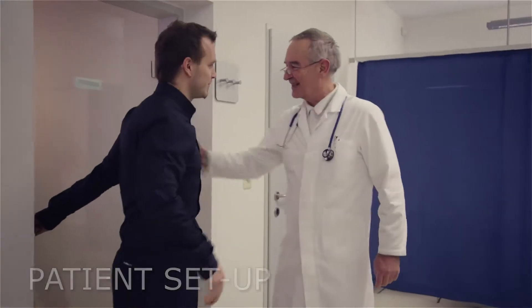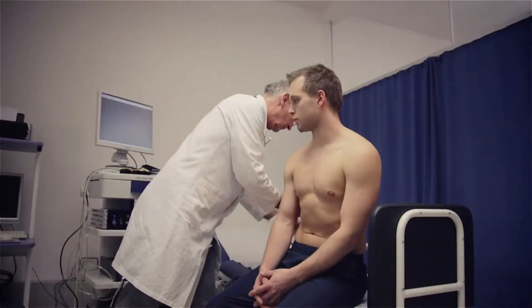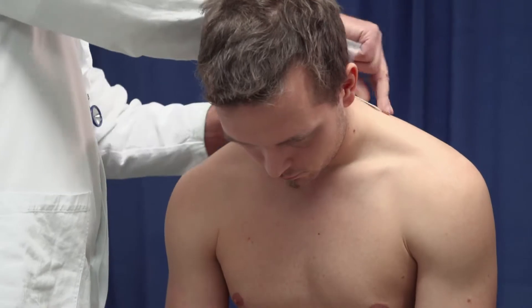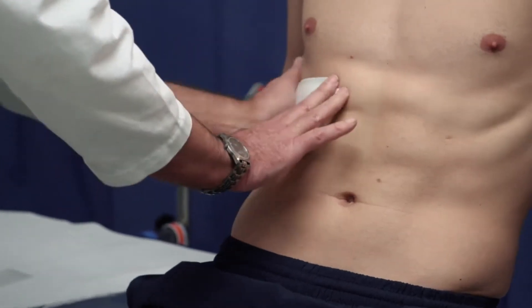The setup process is easy. To obtain cardiac output, three impedance electrodes are used. One is placed on the patient's neck between the hairline and shoulders. The other two are placed at the lateral side of the thorax at xiphoid level.